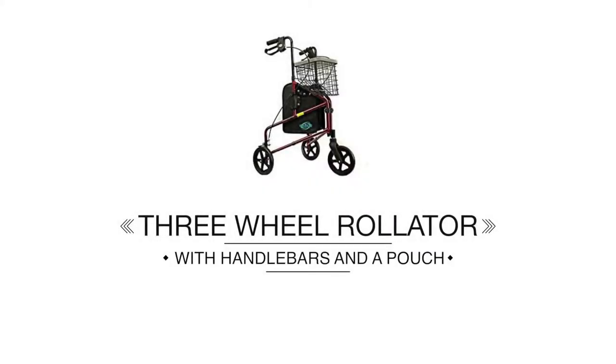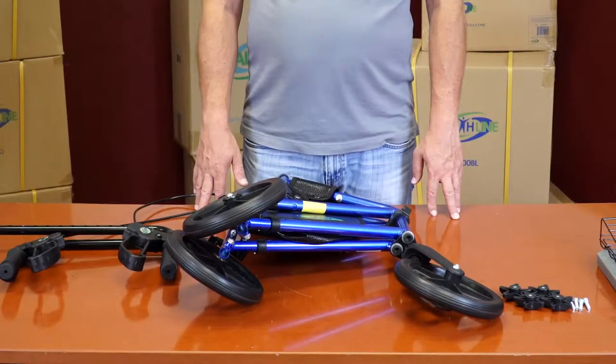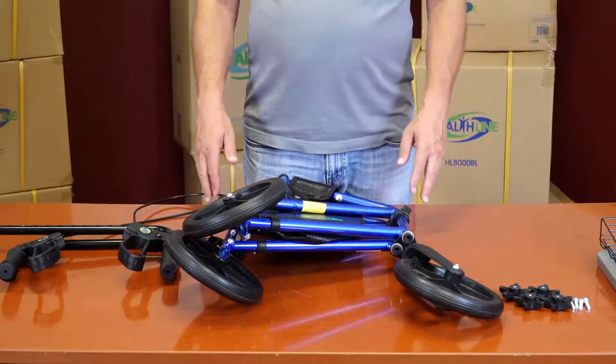3-Wheel Rollator with Handlebars and a Pouch. Your 3-Wheel Rollator Kit arrives in a semi-assembled state. The kit consists of five distinct parts.